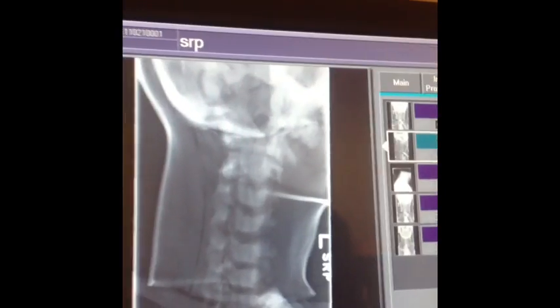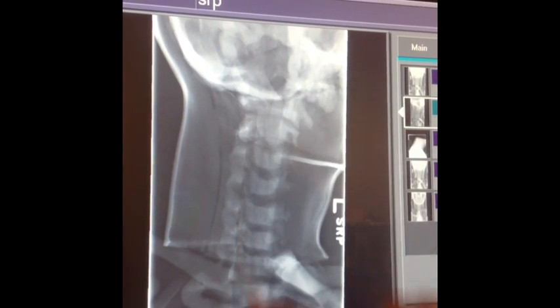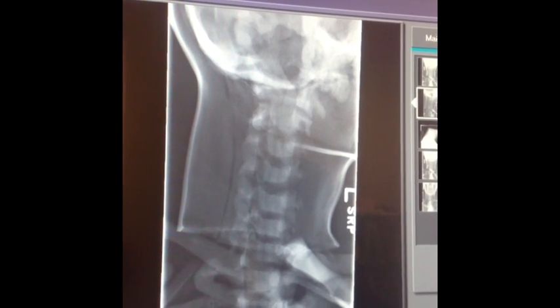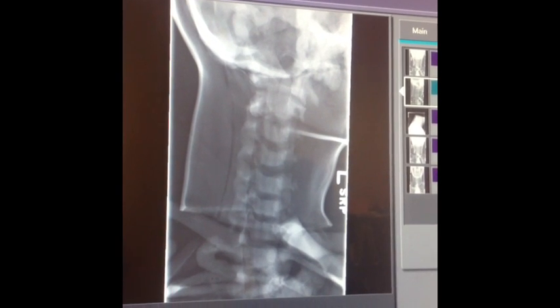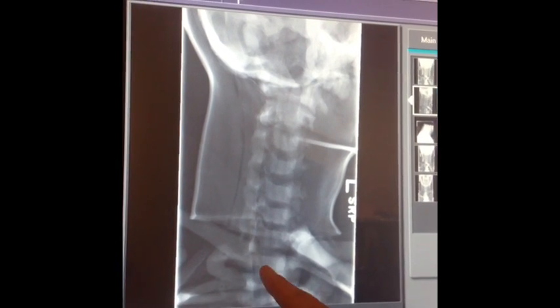For the obliques, we want to see open intervertebral foramina — though it's not a very good image because of the dummy. We also want to see open disc spaces and make sure the chin is elevated. The occipital bone should not be over C1, and we want to see all seven vertebrae and T1.